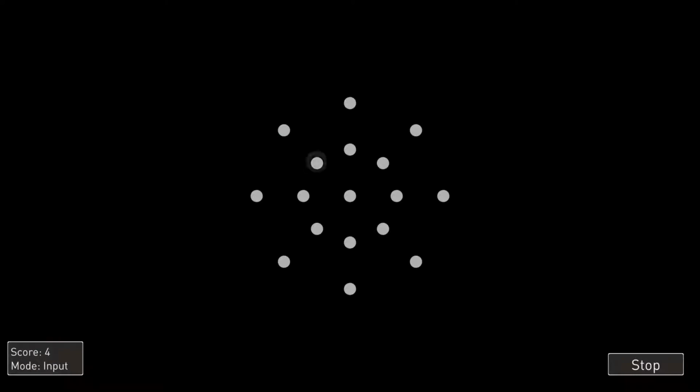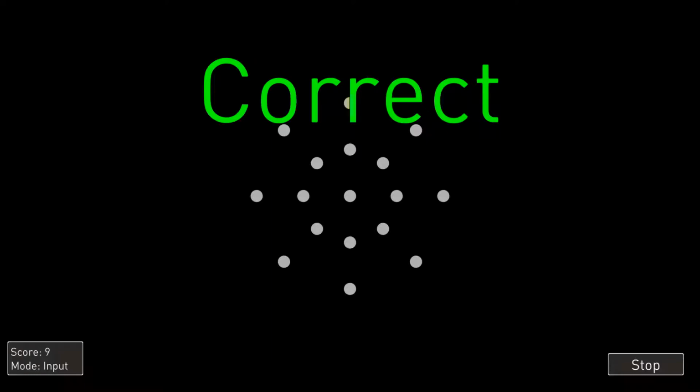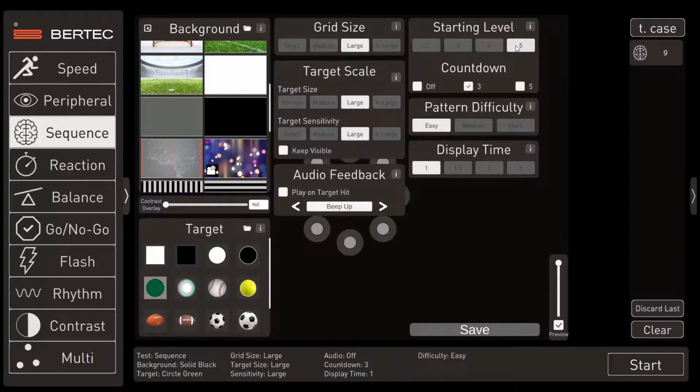You can kind of follow along yourself on the computer screen and even touch the targets if you want. I'll be quiet here for a second. Normally during the baselining, we would be quiet, but as the training progresses, especially with athletes, you can talk to them, distract them, even have them do math problems. Any cognitive demand just makes it more real world. You see, after I miss, the targets pop up and show them the correct sequence. We want to always reinforce to the patient what would have been right.